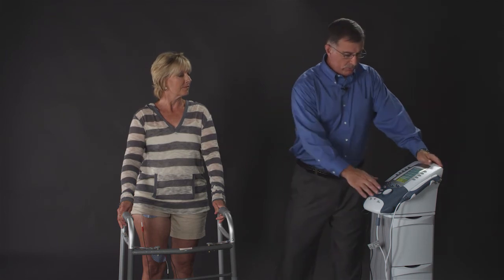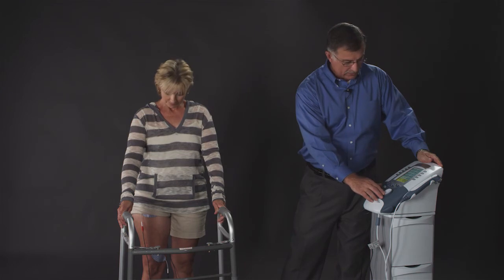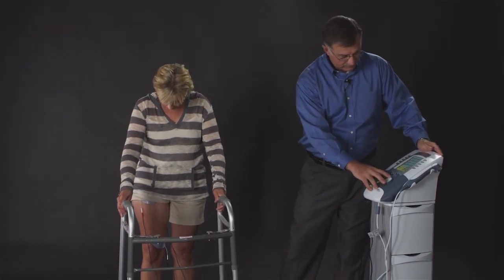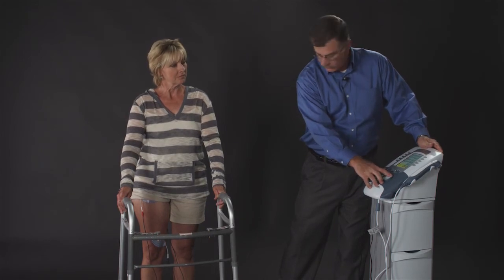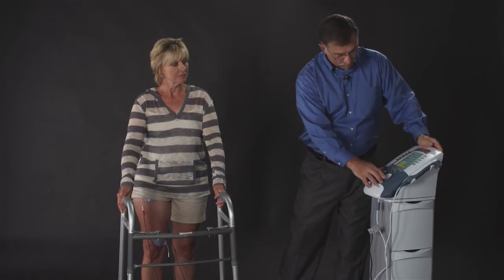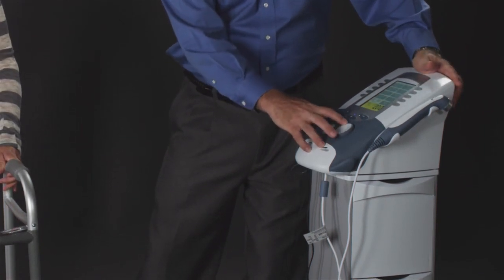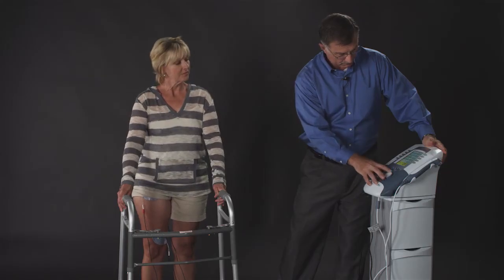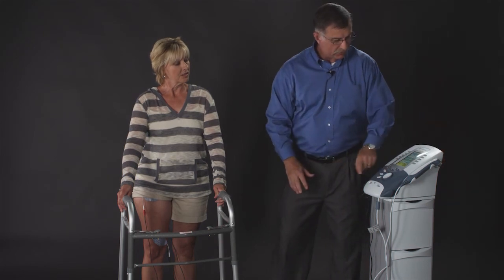The first thing we'll do now is we're going to increase the amplitude until we get a muscle contraction with the quadriceps. We'll turn it up until she feels it. Once she feels it, we'll then continue to get the muscle contraction. Once we get the muscle contraction there, we will now set the muscle contraction for the hamstrings. Once we get the muscle contraction with the hamstrings, we will now press the start key.